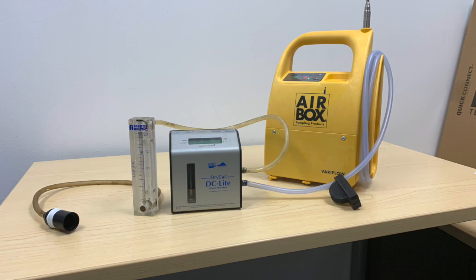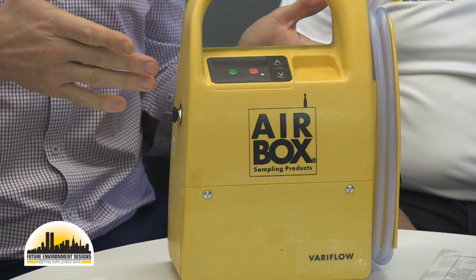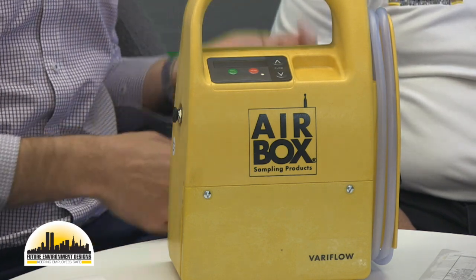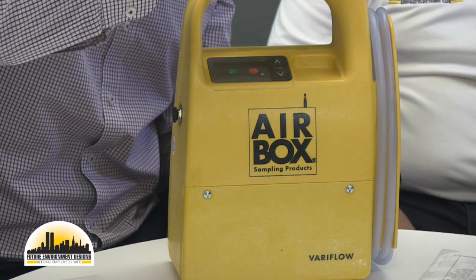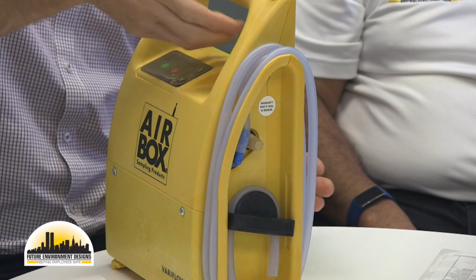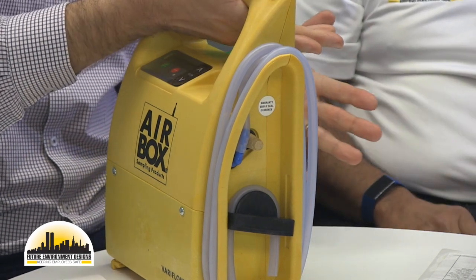Straight out of the box, it's quite a compact, easily set up pump. You would have a telescopic mast, so again, trying to have a product where you're not having to carry a lot of accessories around. That's quite common practice as well. A simple flat back, so with this pump you can carry two back to back.